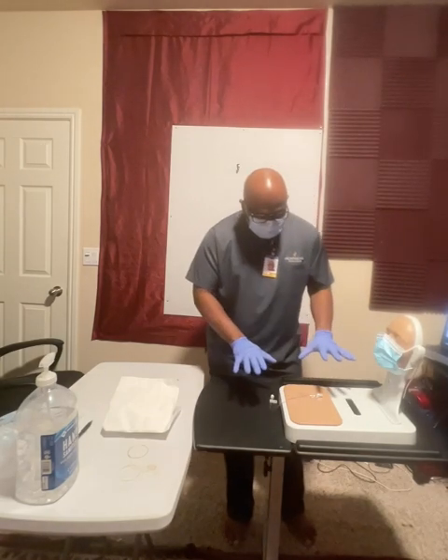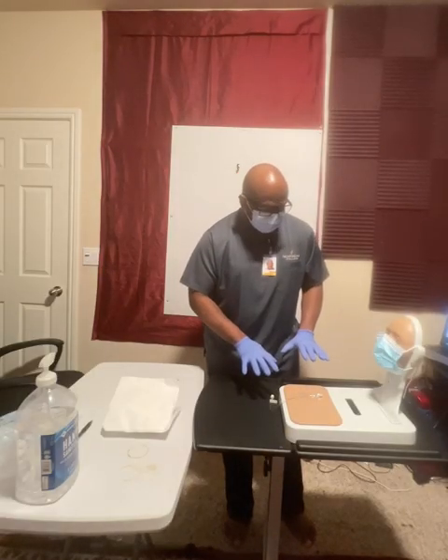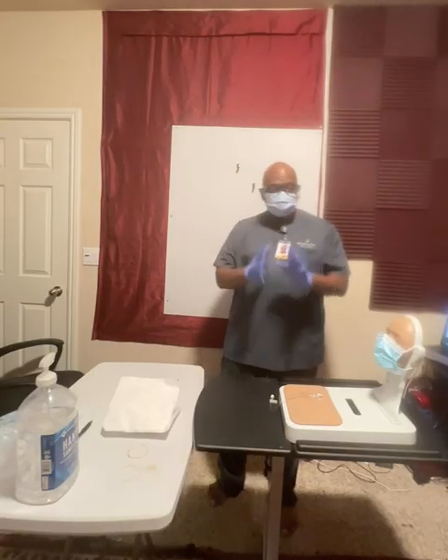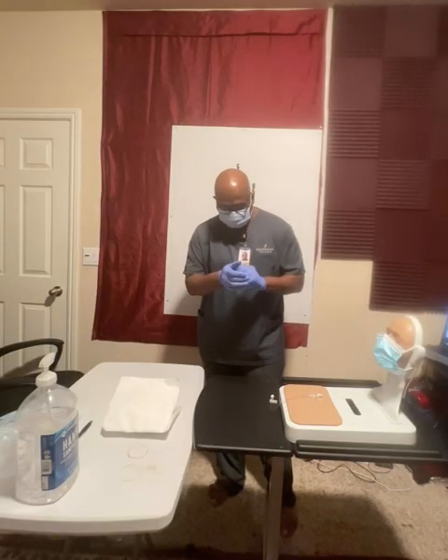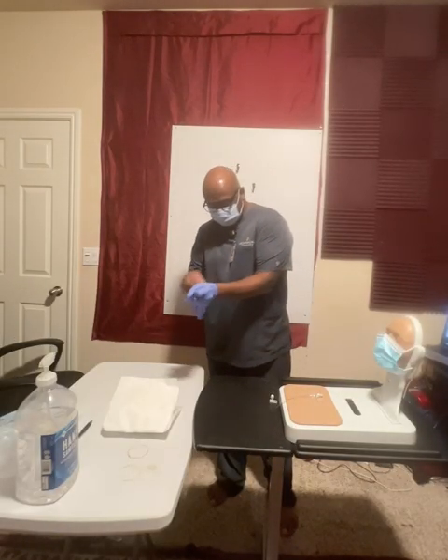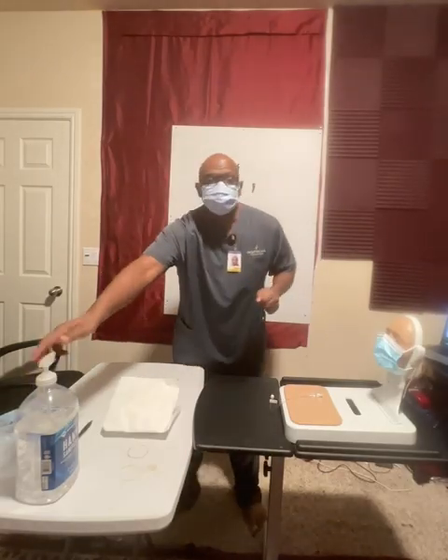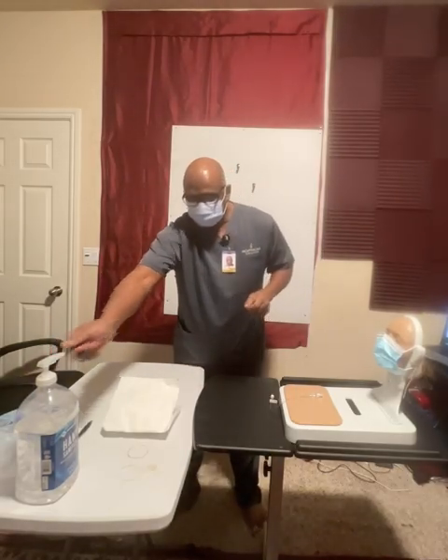Right? So the patient states that everything looks okay. The catheter looks good. It's intact. There's no kinks in it. So that's good from there. So what I'm going to do is I'm going to get rid of these gloves. Right? Let's take that. And we're going to dispose of those gloves. I'm going to do hand hygiene, right? Hand hygiene.